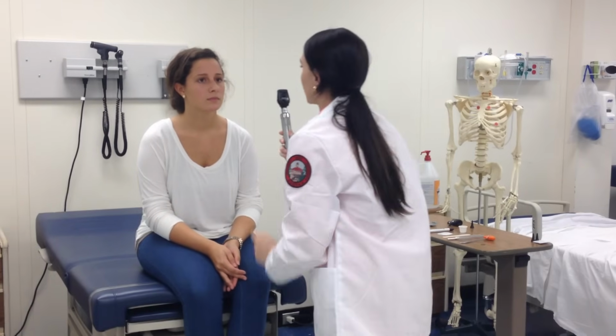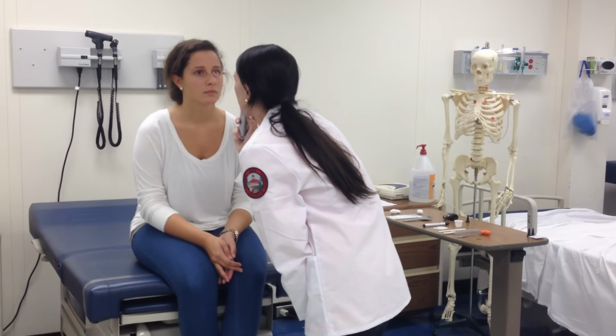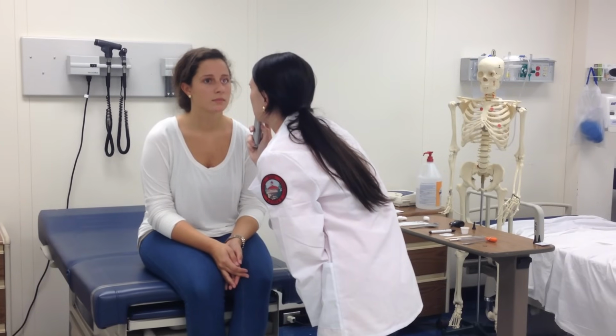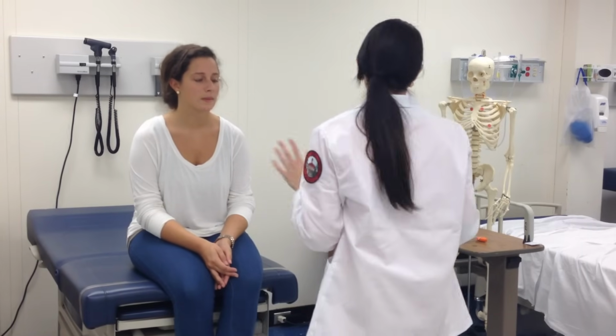Okay, you're going to stare straight ahead for me. Okay, the red reflex is present. The optic disc is creamy yellow, and arteries and veins are visible, and they're paired. Okay, which is completely normal. And I would do the other eye, but for time purposes today, we're going to just do one of each thing. Okay.